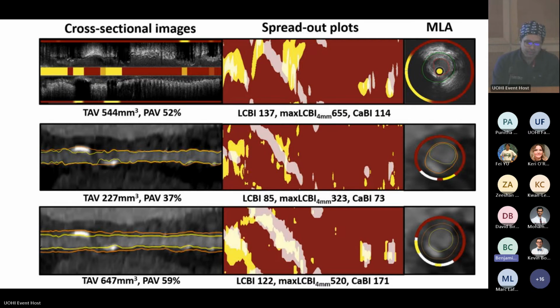If you look at the studies that have been done, they actually have human readers segment out the artery in short axis, millimeter by millimeter, to get it done accurately. And even then, the predictive value, as was highlighted in your talk, is not super great. The other learning point and teaching point exists on this slide, right? So this is, I think, a take-home message.